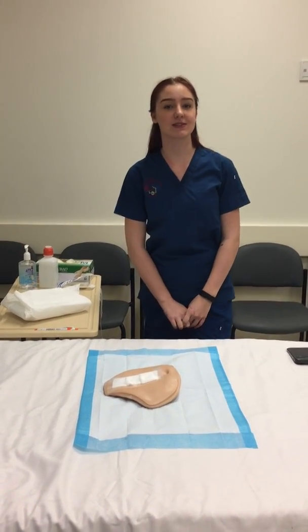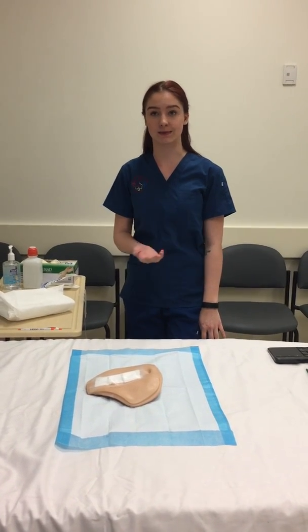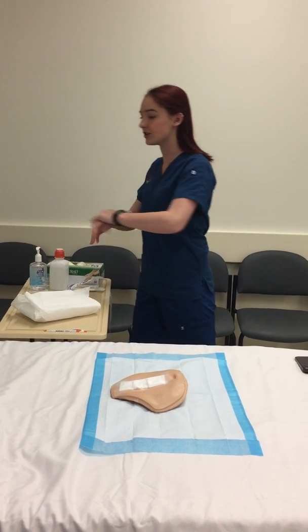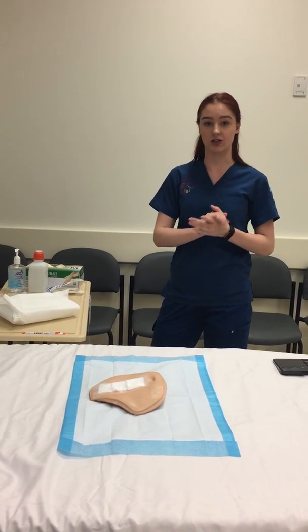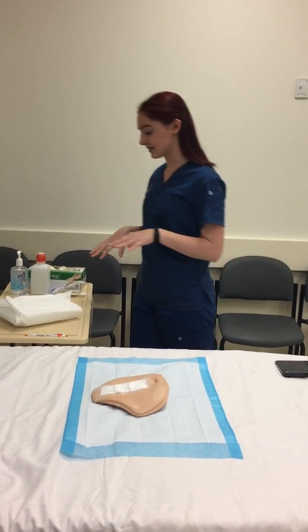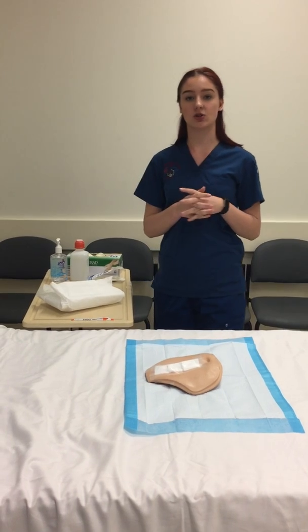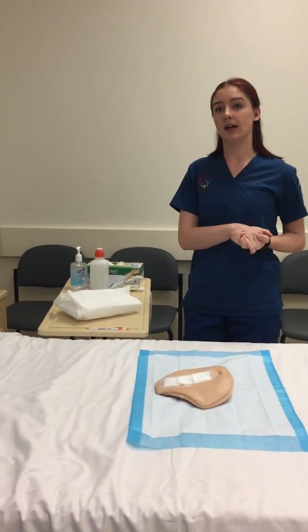I'm a level 2 nursing student, and today I'm going to be showing you how to do a wound care dressing change and assessment. So when I first walk into my patient's room, I'm just going to perform hand hygiene, and then I'm going to verbalize the order change from the physician. So this is Mr. Mancini, and the order is to do a dressing change twice a day with normal saline and apply dry gauze with tape over top.